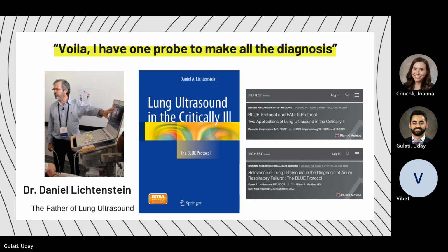There are protocols for trauma exams, for post-intubation exams. But really, I find this one really good for kind of half of our RRT calls, right? There's hypotension and then there's shortness of breath. And so how do you approach the dyspneic patient? The one thing I will say about this exam is that it does not involve a good cardiac echo exam, which I would still recommend doing, at least a focused one, in the dyspneic patient.